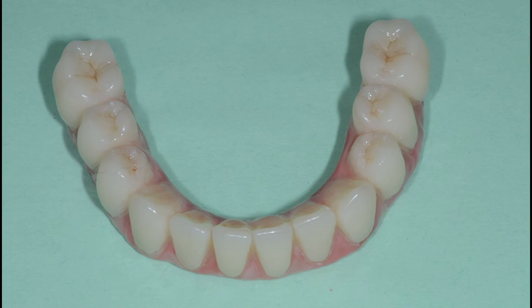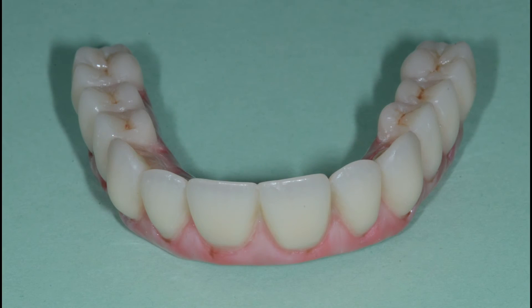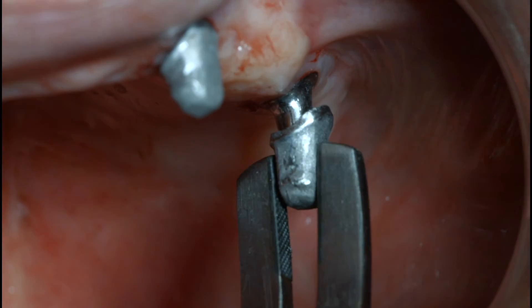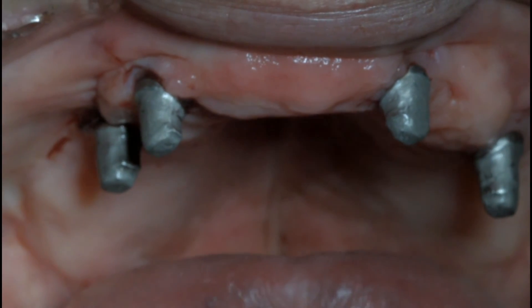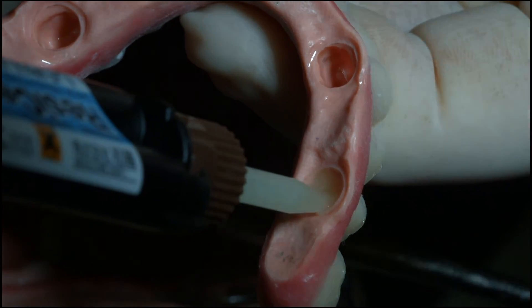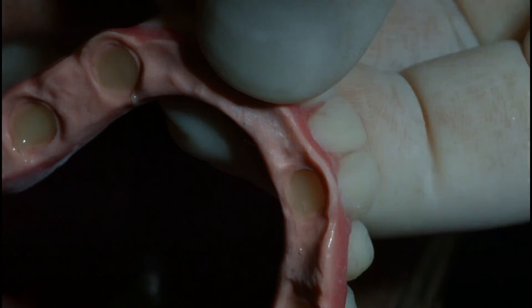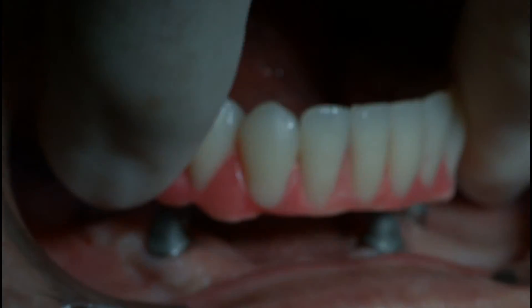The finished TRINIA prostheses and resin seating jigs with sequential markings were delivered to the dentist for insertion of the eight parallel milled abutments into the wells of the implants, and for the fitting and resin cementing of the eight cast chrome telescopic copings into the bores of two full-arch CAD-CAM fiber-reinforced resin prostheses. Vaseline was applied to the bores of the cast chrome-cobalt copings to facilitate their withdrawal from the parallel abutments during intraoral fitting and cementing to the TRINIA prostheses.